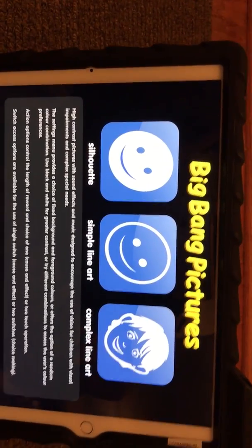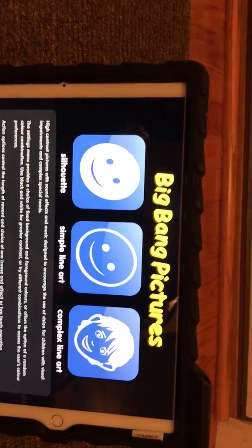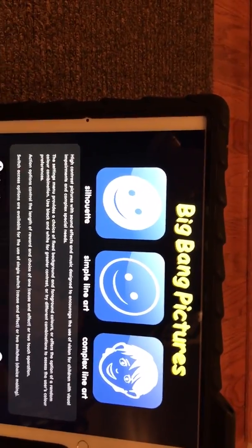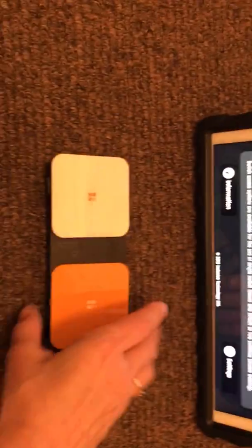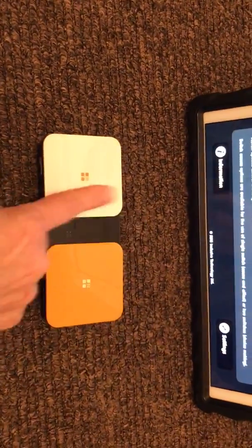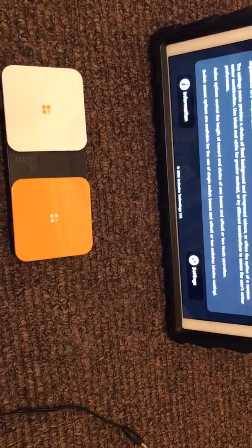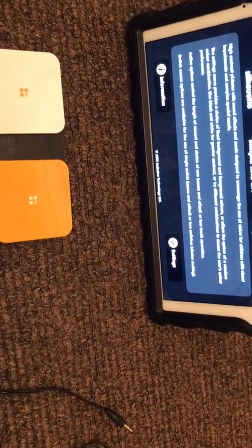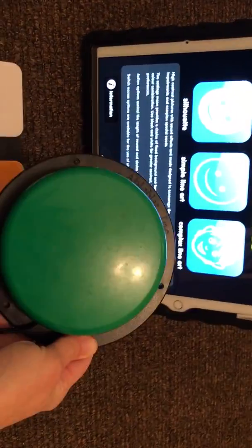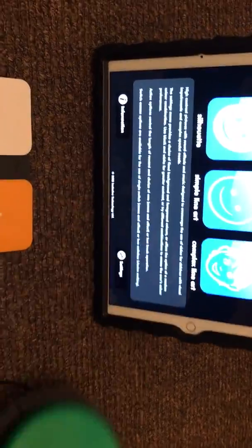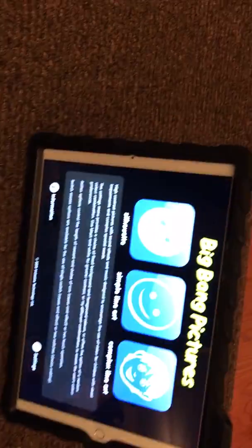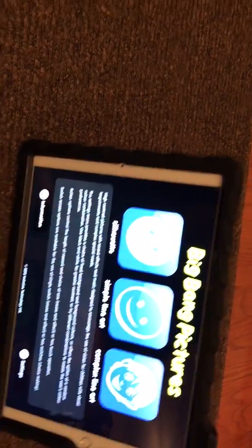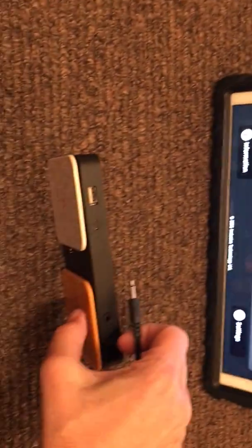If you don't want to use the actual Bluetooth switch and you have an external switch—if you have a jelly bean switch or something else that your student really likes—you have to give it a plug-in and you can do that right here on your Bluetooth switch.